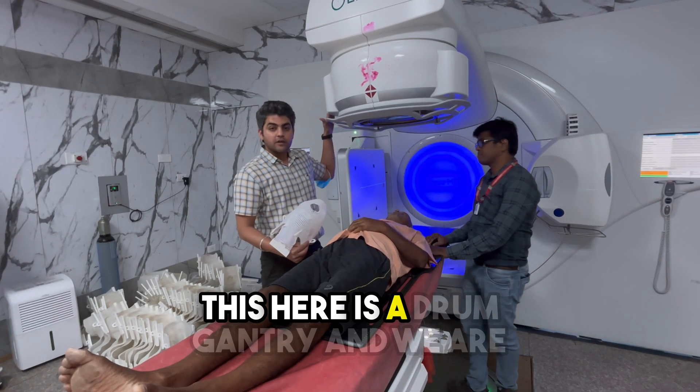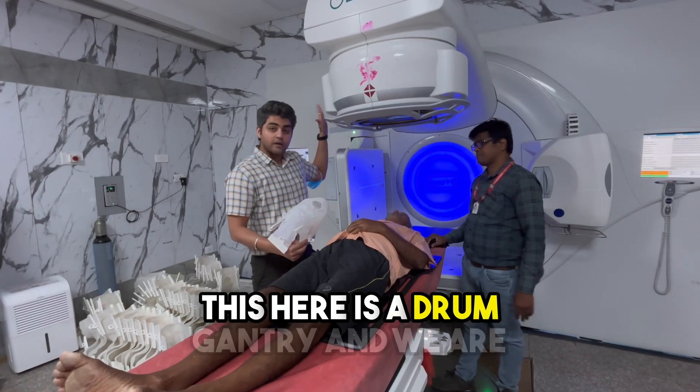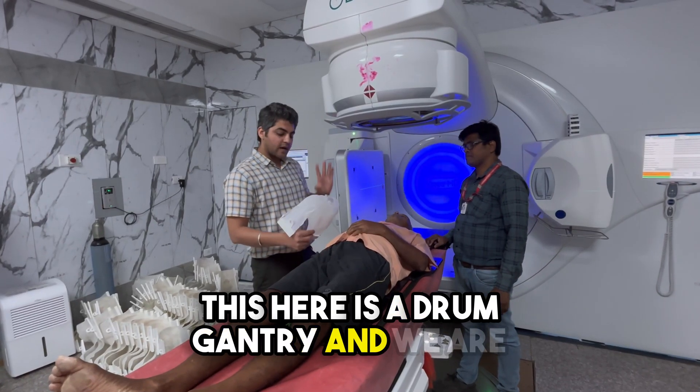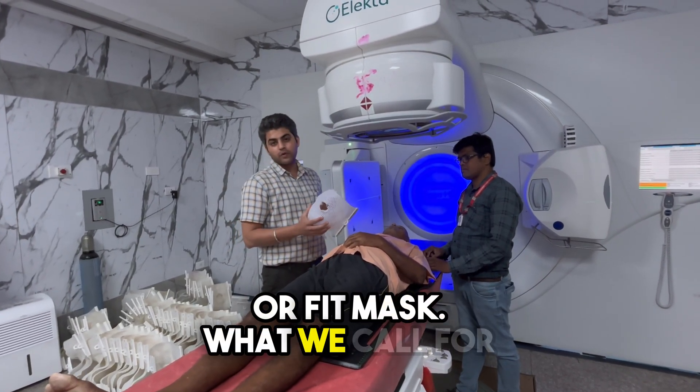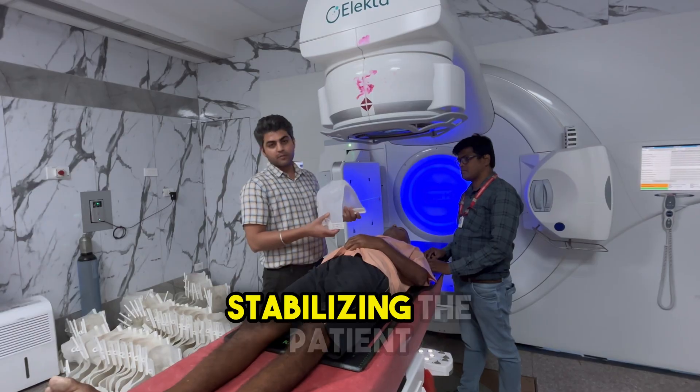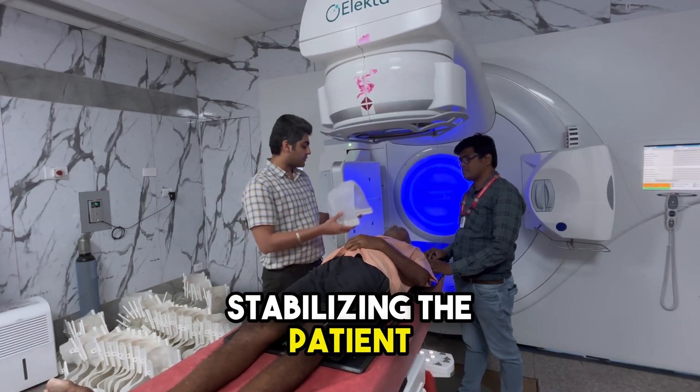This here is a drum gantry and we are using a thermoplastic cast — or Orfit mask as we call it — for stabilizing the patient.